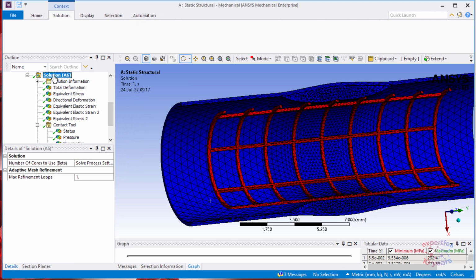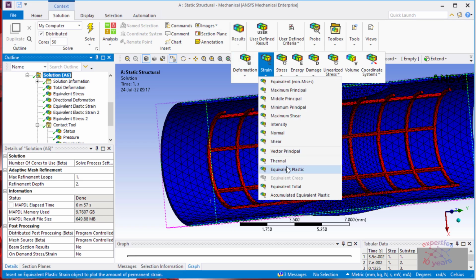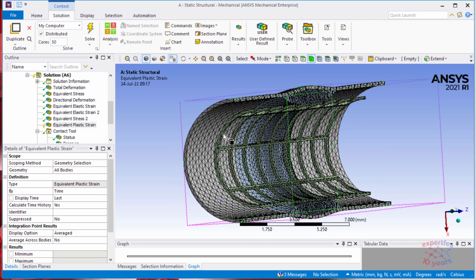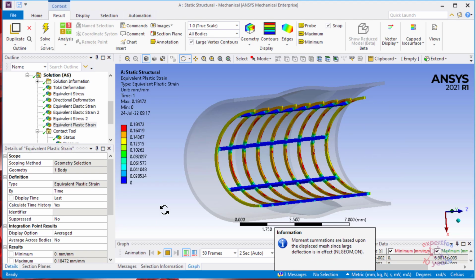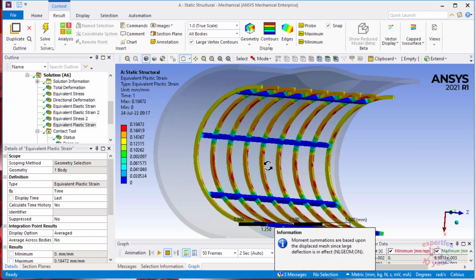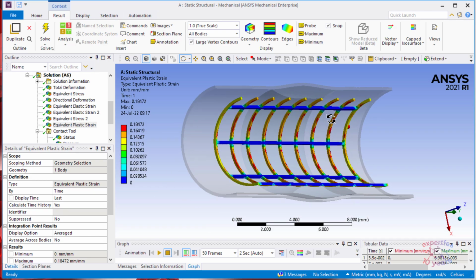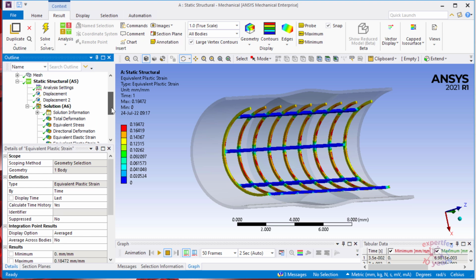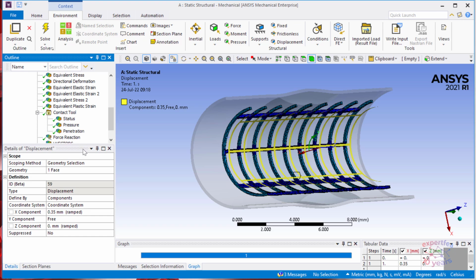Let's see, just for fun, if we have plasticity inside the stent. Let's click the stent, all bodies, and evaluate our results. Yes, we have plasticity. So this is why, if we change here from 0.35 to 0.25, I'm sure the values would be much smaller. I will do this in the next FEA.